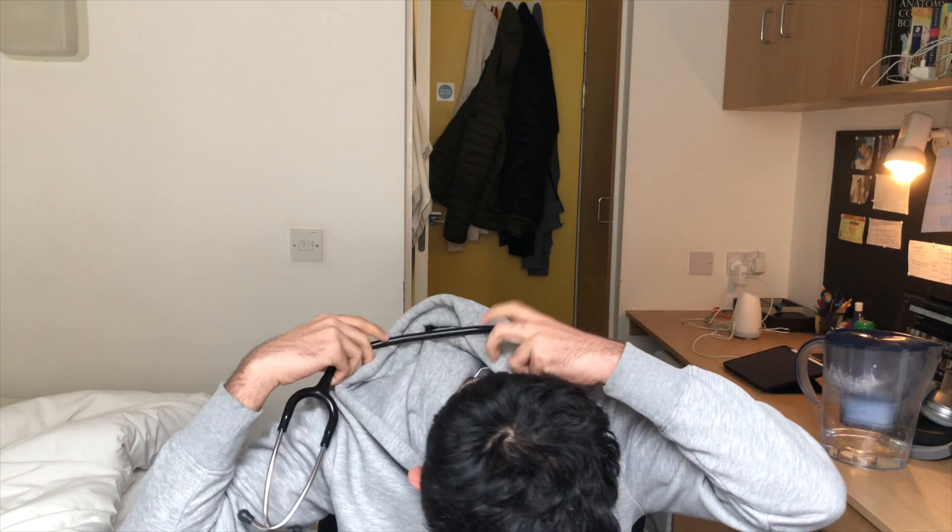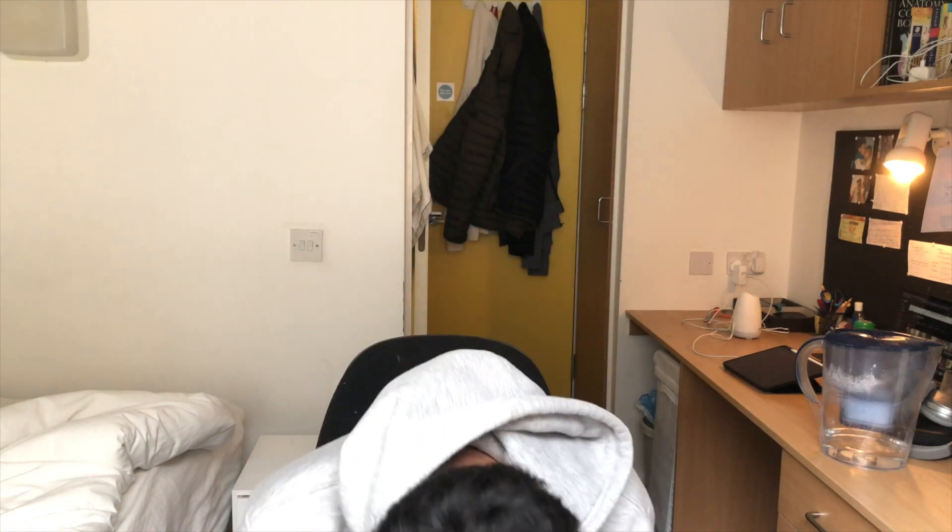I'm gonna try it out. Let's wear it and see what it's like. Oh my god, this is so cool. It feels so cool. Look at that — oh my god, I feel like a doctor already.